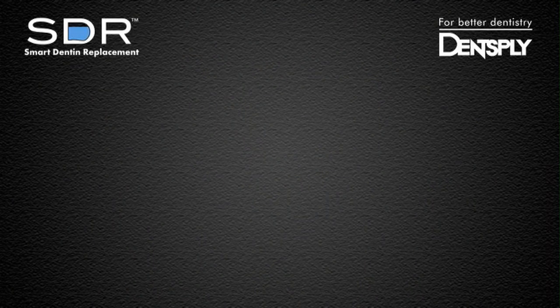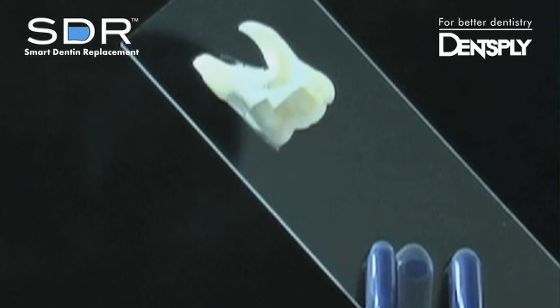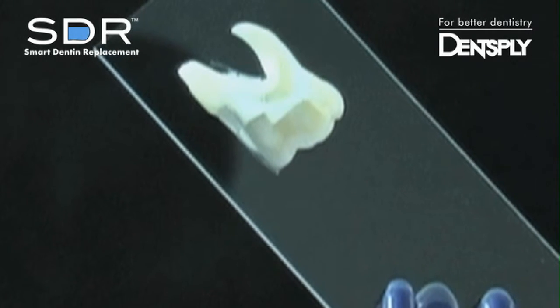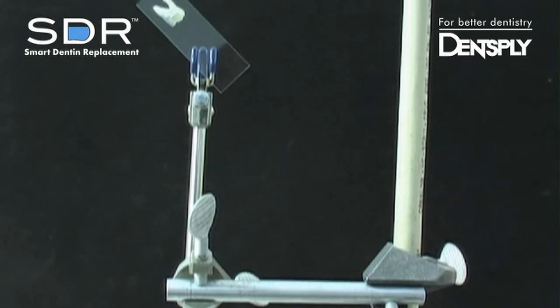Even when you're performing maxillary restorations — to demonstrate, a human molar was prepared for a large class II restoration. The tooth was cut in half and adhered to a standard glass slide. A matrix band was placed to seal the proximal box. The glass slide was positioned at a 45 degree angle to mimic a maxillary restoration.